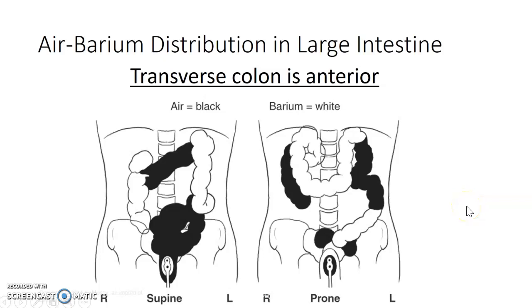All right, we're moving on to BE with air. So I'm going to start with just a quick tip for understanding the air barium distribution in large intestine.